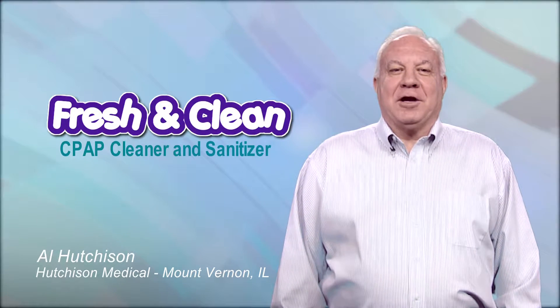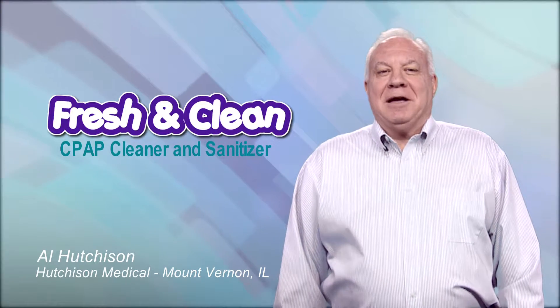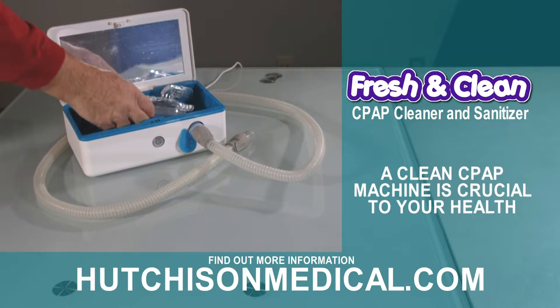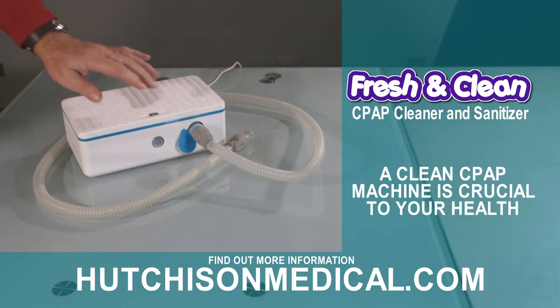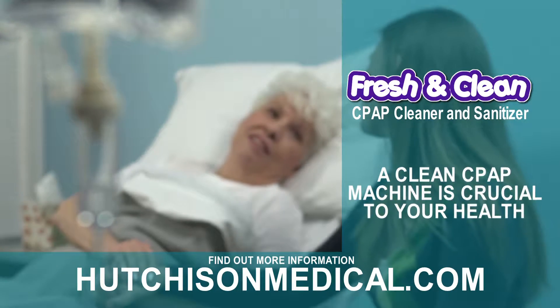Hi, Al Hutchison for the Fresh and Clean CPAP Cleaner and Sanitizer. If you use a CPAP, cleaning your CPAP equipment regularly is crucial to your health. You don't want bacteria, viruses, and mold causing infections or sickness.